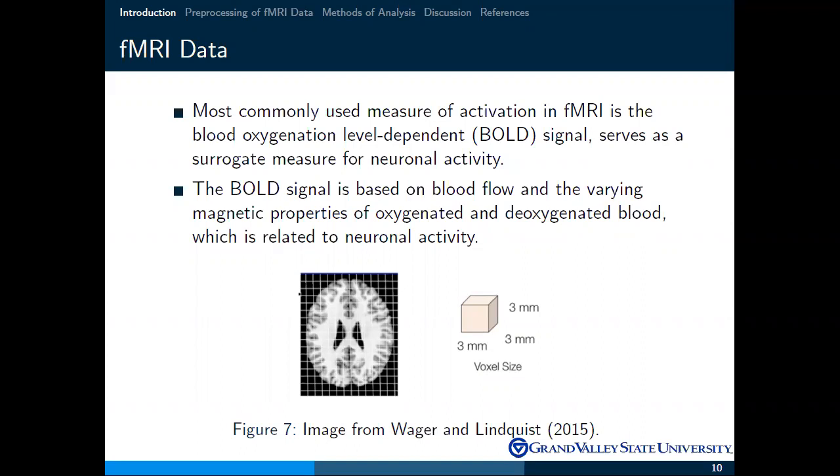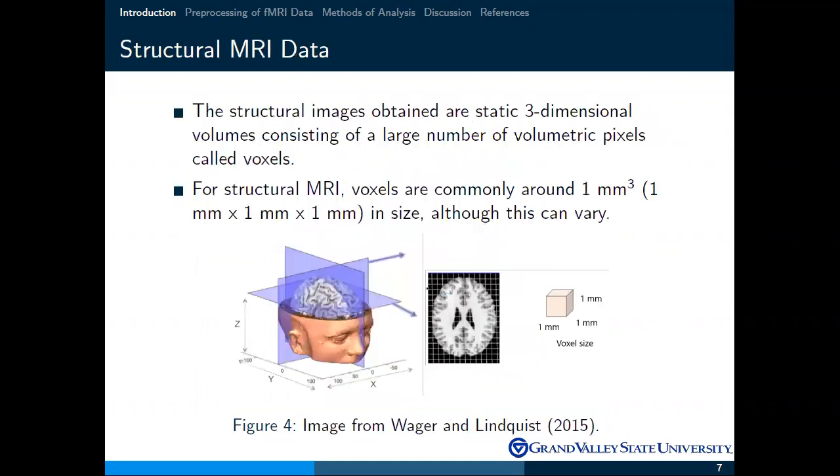Yeah, so that gets at another step in the pre-processing pipeline that I had to leave out for time here. When the MRI scanner acquires the scan, it gets one slice at a time, starting at the top of the head, and then moves down, slice by slice, all the way to the bottom. In that way, each slice has the same resolution, but there is an effect of the difference in time at which those were recorded.